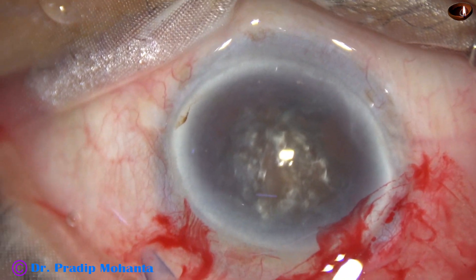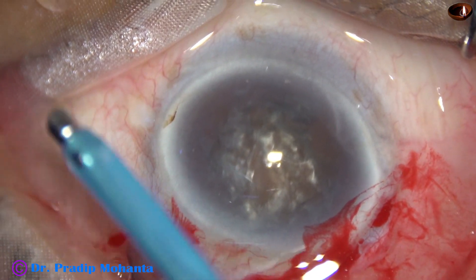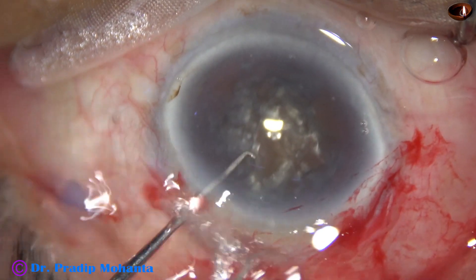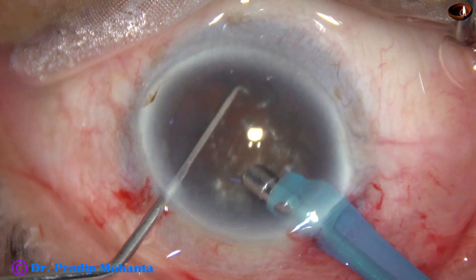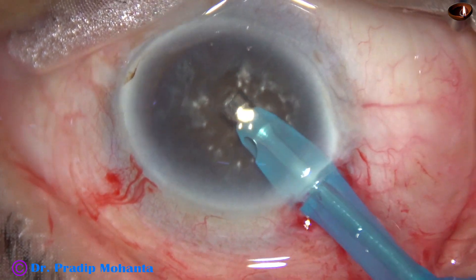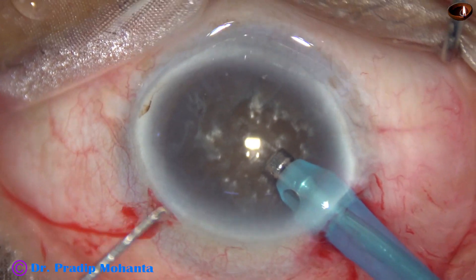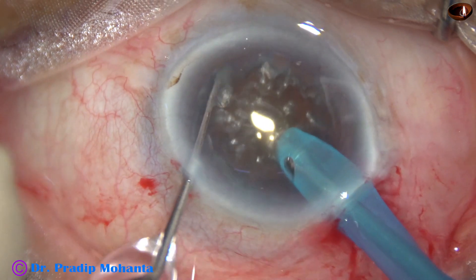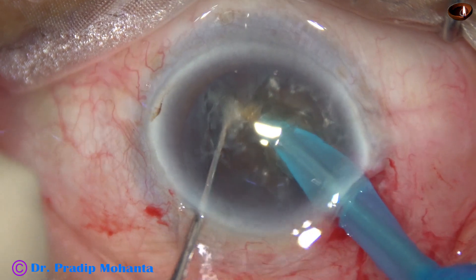And now is the time to introduce the phaco needle into the anterior chamber. Here it goes. The phaco needle goes very well down. Some superficial lens matter is aspirated. The handpiece is turned to make the bevel up. And now I come near the main wound, push the nucleus a little down, and go into the substance of the nucleus.